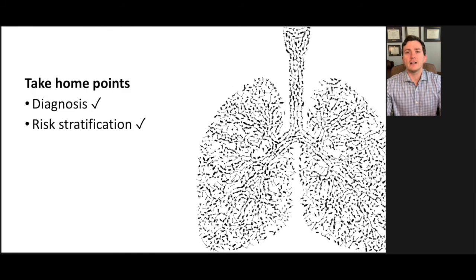In closing, like other studies that have shown lung ultrasound useful in detecting pulmonary edema, we also found lung ultrasound to be useful for determining the presence of pulmonary edema in patients coming in after submersion events. It's so easy, even a novice can do it.